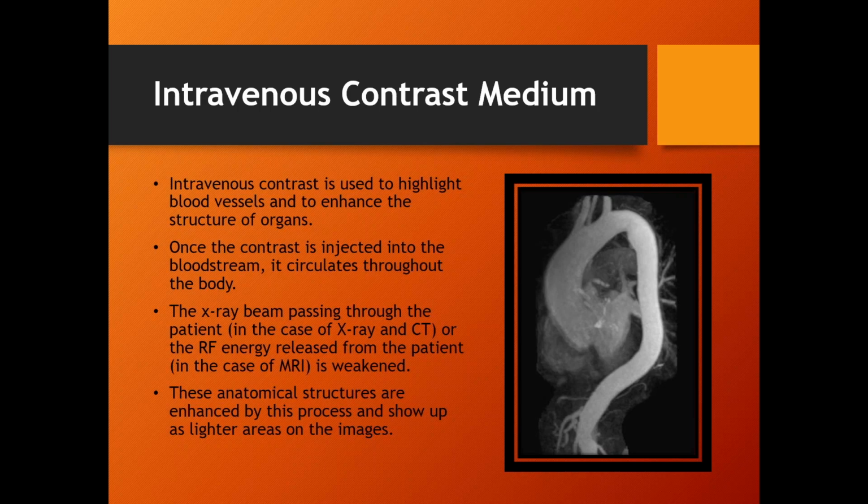Now that's nothing that we as BMEDs have to worry about, but you do have to keep in mind when they're using this fluid to take a shot of this particular vein or artery, it's on a living patient. And every time that heart beats, the blood in the vessels moves. So we might fill this chamber up with contrast right now, but we have literally less than 1 second to pop that shot, because as soon as the heart beats, it moves. Heart beats again, it moves.